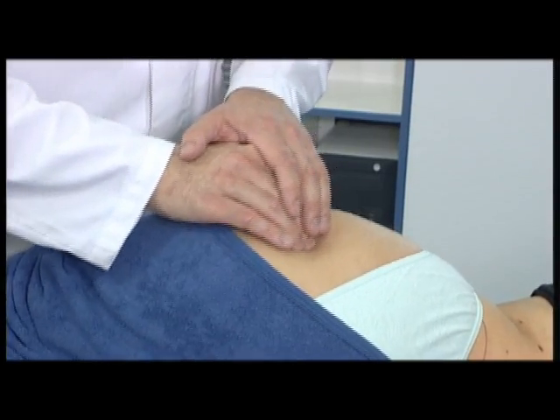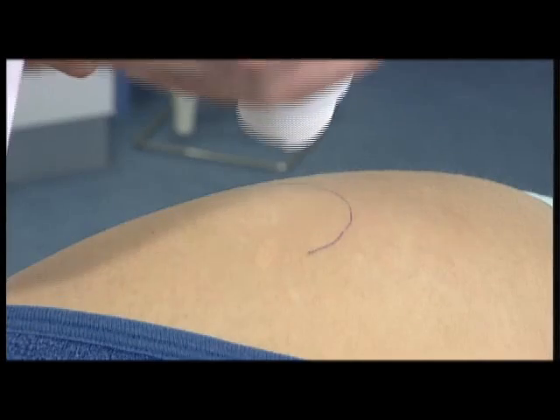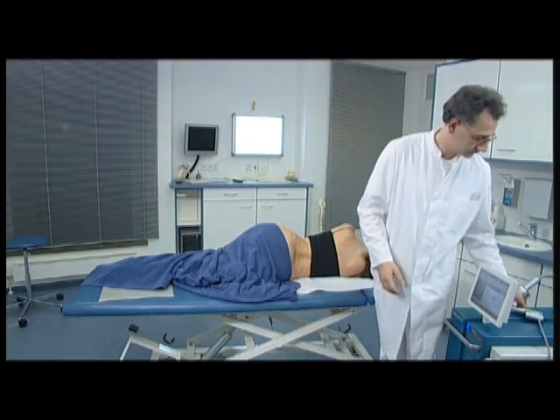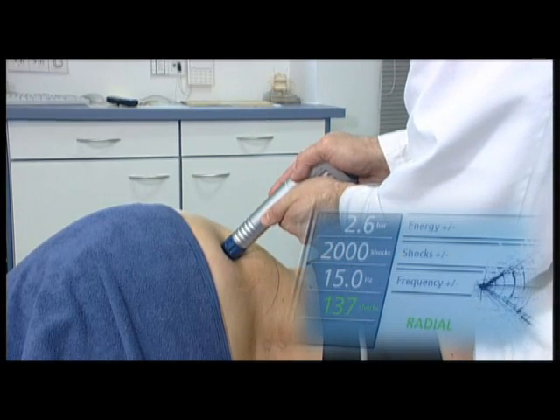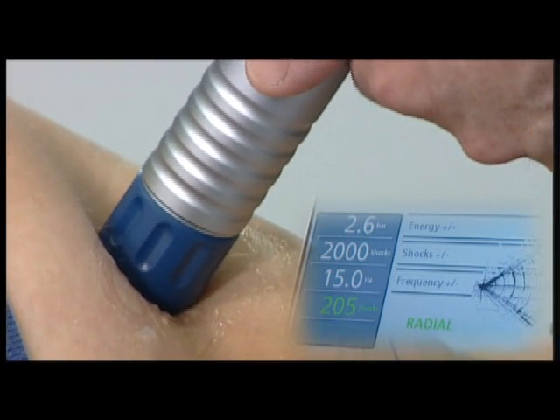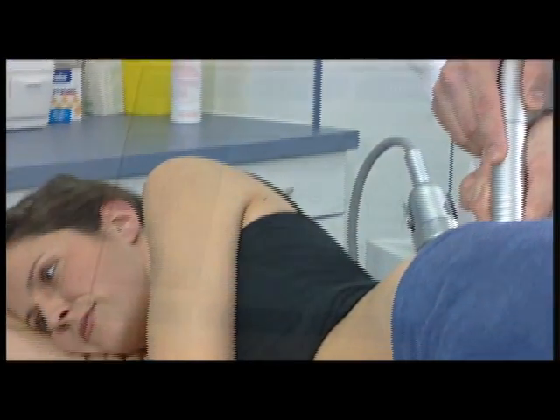Before treatment is started with the Duolith SD1, the painful spots are localized by palpation following the patient's indication of pain. Afterwards, coupling gel is applied to the skin. Treatment is started at the point of maximum pain using the patented radial D-actor technology. The deeper seated the pain region, the higher the application energy can be selected, and the more firmly the D-actor can be pressed on the application area.